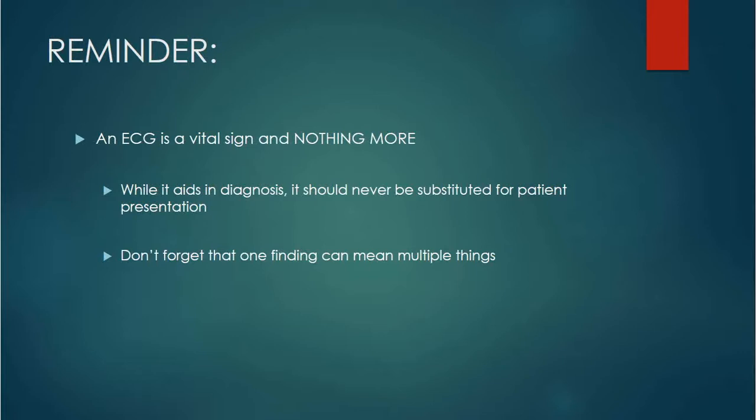All right, so quick reminder, an ECG is a vital sign and nothing more, okay? You don't make incredible or risky clinical decisions based on just an ECG. It does aid in diagnosis, but it should never be a substitute for the patient's presentation. Your patient needs to present as critical before you make risky decisions and things along those lines, okay?